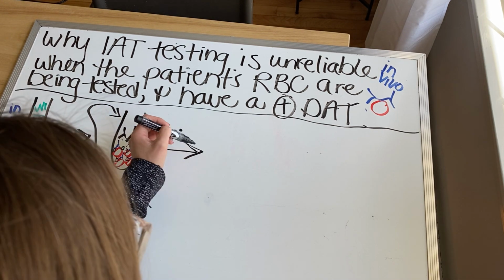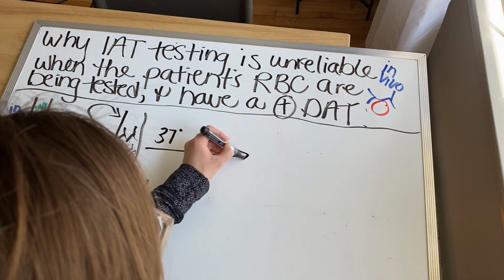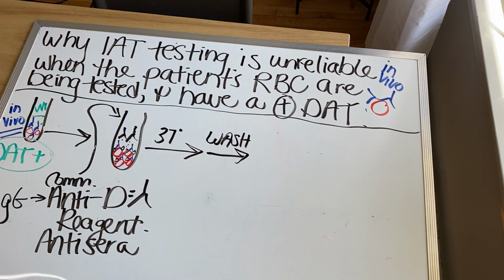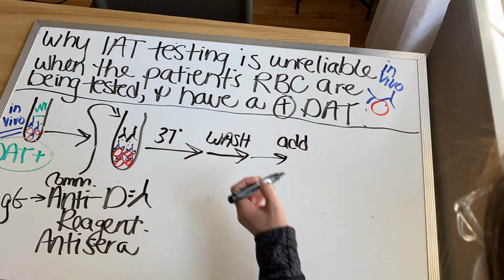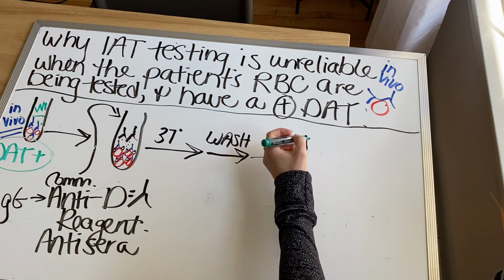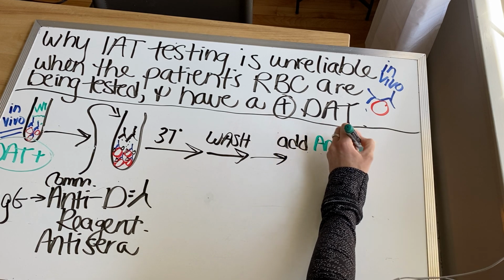And then we wash away unbound. And then we have to add anti-IgG.